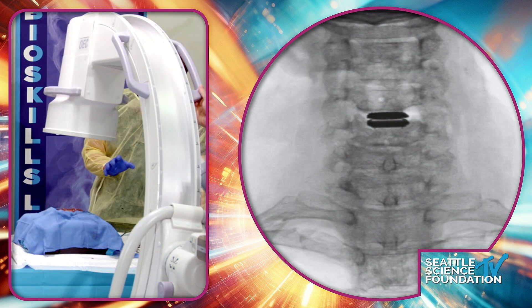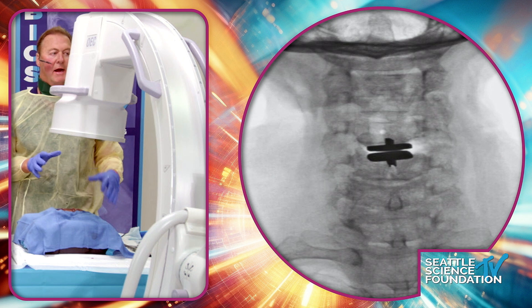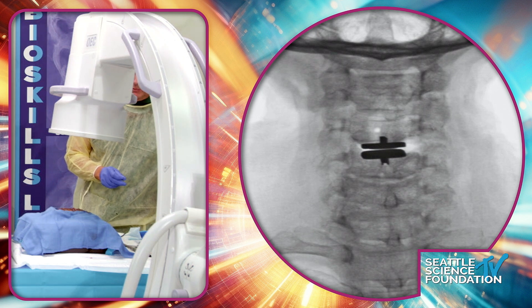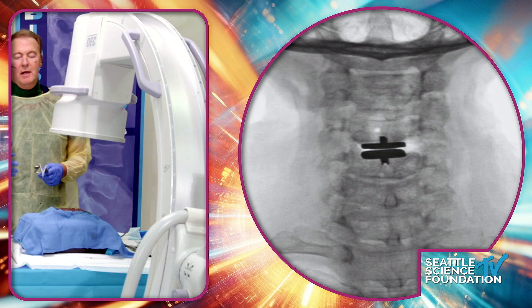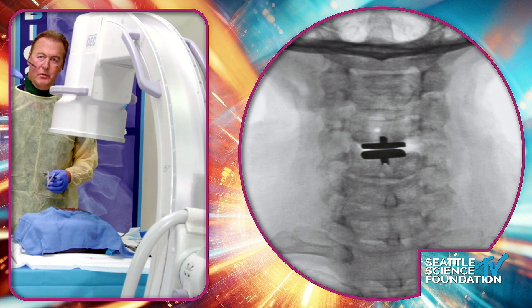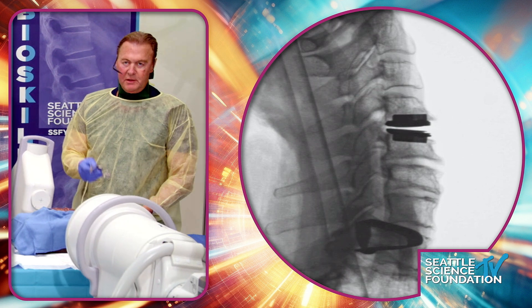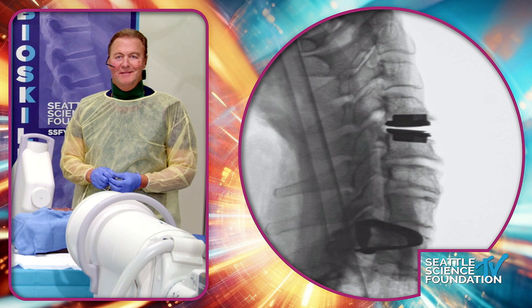The other thing I do when doing the AP shot with the trial in is remove all retractors — it's a hassle but you get a really clean AP view. That's how I like to do the revision, switching to different discs. This is usually my go-to disc — I don't switch to Simplify often. I prefer a keeled implant on a revision because you get a lot more stability with the keel, especially on lower cervical segments C5-6, C6-7, where you have a slope angle and potential shear force. The Sentinel distractor has been very helpful — I have long and short ones.